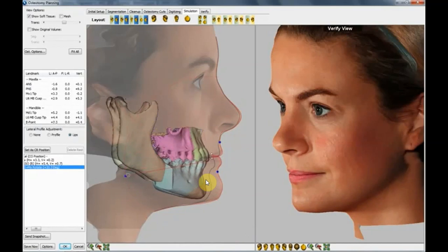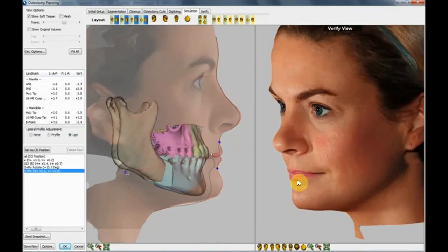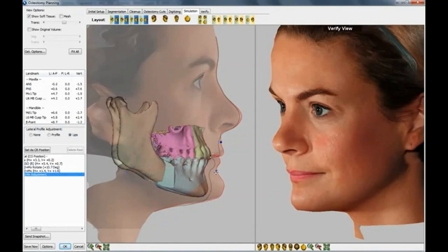So if you feel both maxilla and mandible moving together forward is what is making the patient look better, then you plan an appropriate myofunctional appliance to redirect the jaw growth in that direction. Or if it is a non-growing patient, then you are going to plan an appropriate surgery.